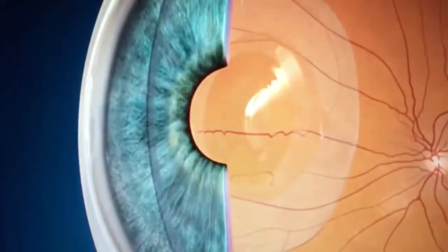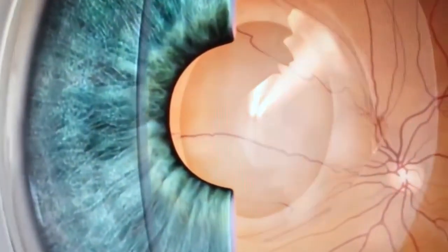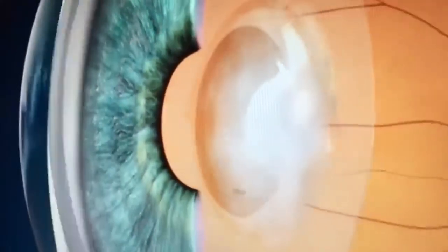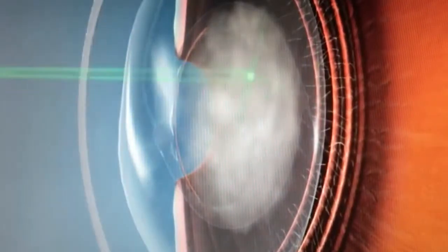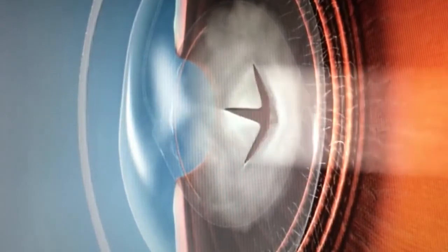Now, at the time of cataract surgery, the capsule is usually clear, but in time the capsule can become cloudy, kind of like wax paper, due to natural healing. This happens to about 1/3 to 1/2 of all patients who have cataract surgery and usually occurs months to years later. Actually, in some cases, the capsule can be cloudy from the very start, depending on the type of cataract. To you, it may seem like you're getting a cataract all over again because you're looking through this cloudy film. It is this back surface of the capsule that is the target of the laser procedure that I'll describe.